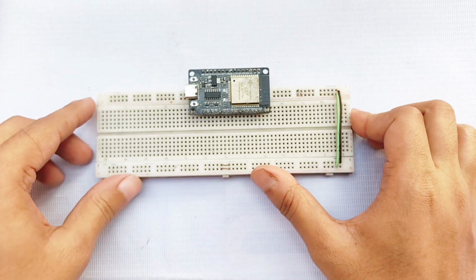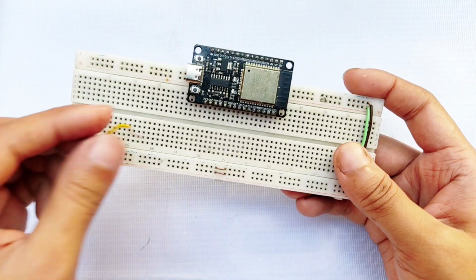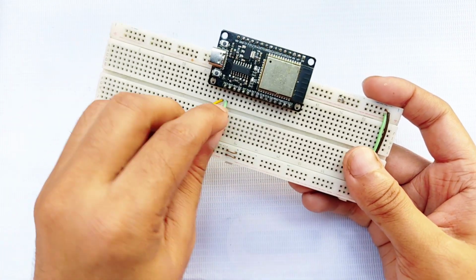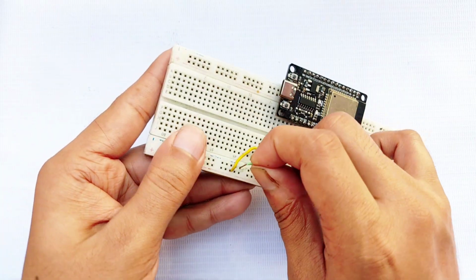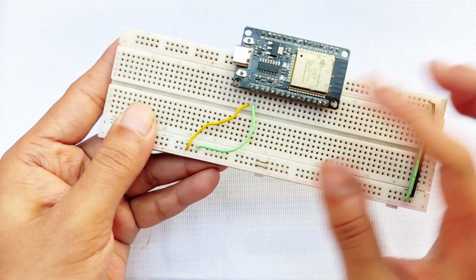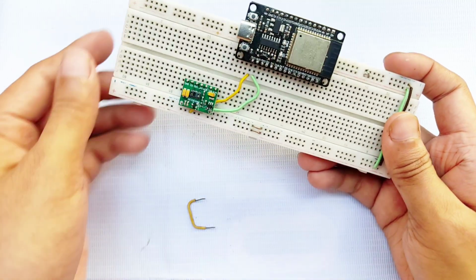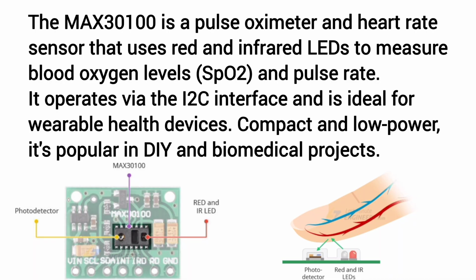Place the ESP32 on the breadboard, then connect its 3.3-volt pin to the positive power rail of the breadboard and the ground pins to the negative rail of the breadboard. Next, mount the pulse oximeter sensor on the breadboard. The MAX30100 uses red and infrared LEDs to accurately detect pulse and blood oxygen levels.